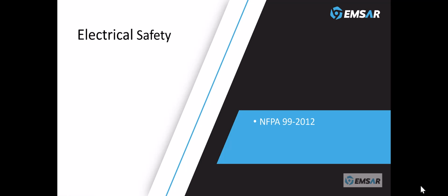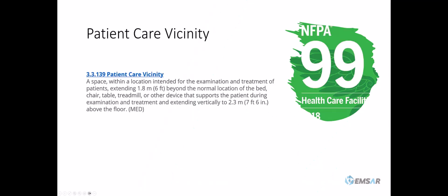Part 2. Welcome back. This section we're going to cover NFPA 99 2012. To get started, we're going to cover a couple of vocabulary for healthcare in general. The first one is patient care vicinity.